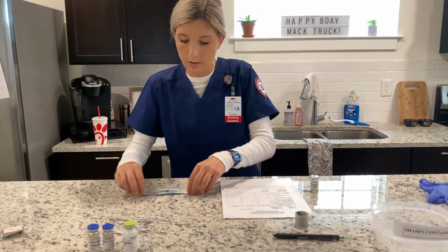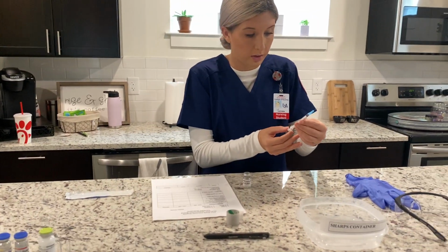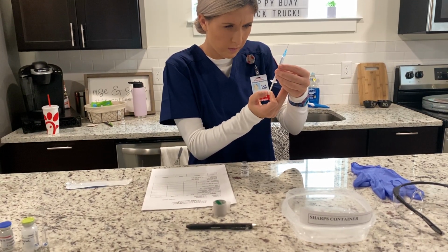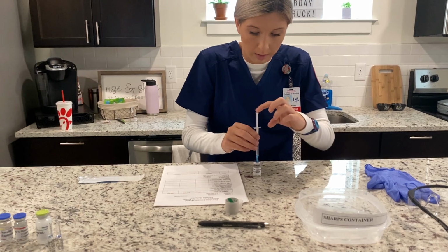And then I'm going to take my TB syringe, and I'm going to uncap it, and I'm going to draw up 0.5 milliliters of air. And then I'm going to inject in the vial, and I'm going to release the air.